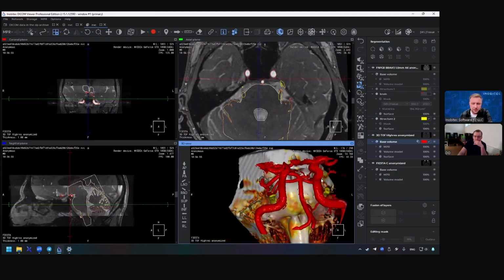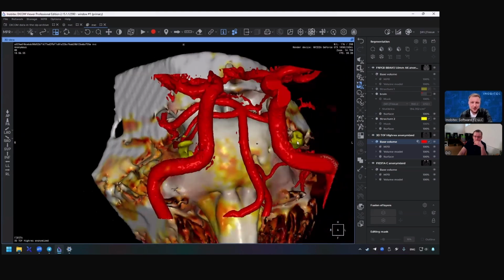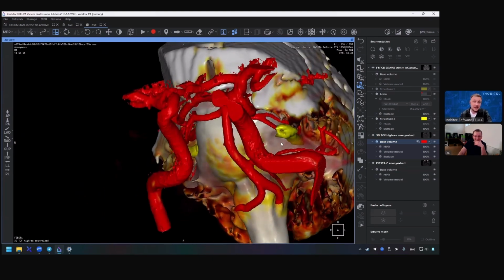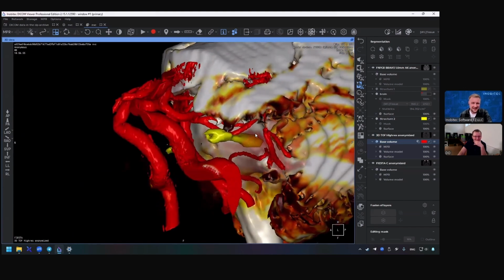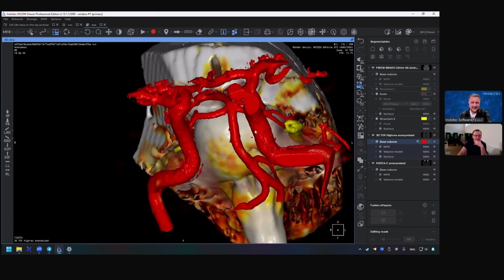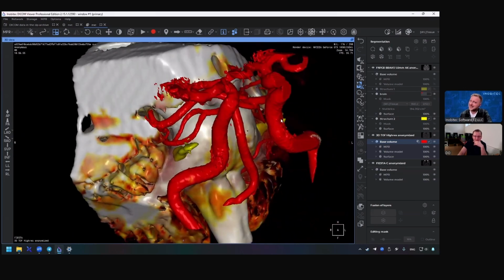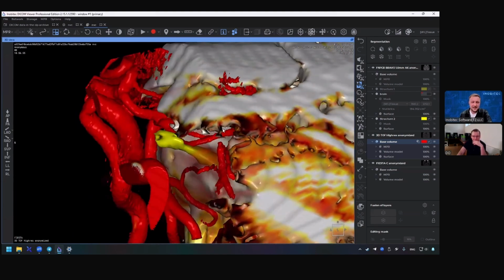Yeah, that looks really impressive. I wonder, how did you manage to do this kind of job before you had such a technology? Yeah, it was kind of magic. Intuition. That looks great. Using our intuition. You must have been great at that.